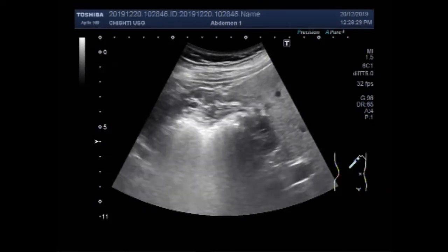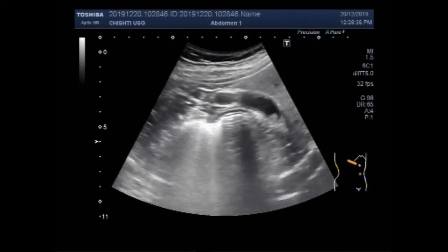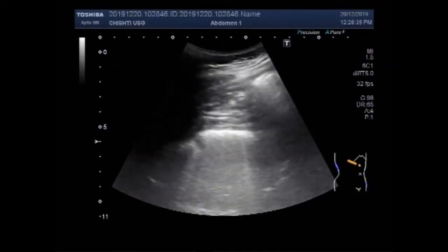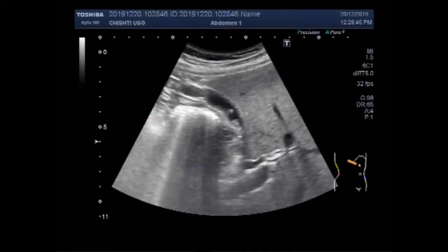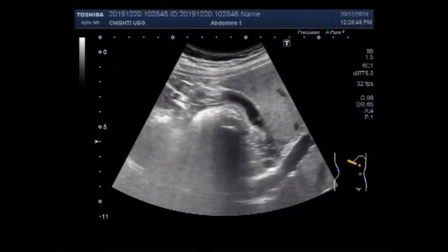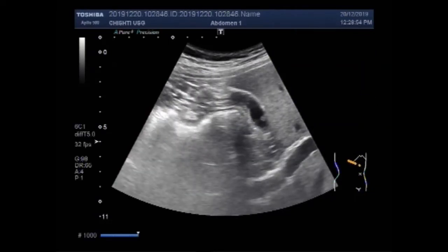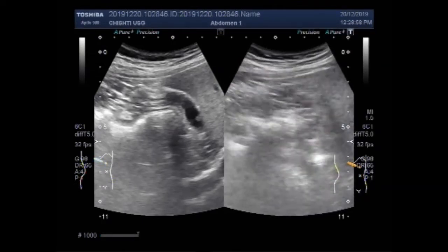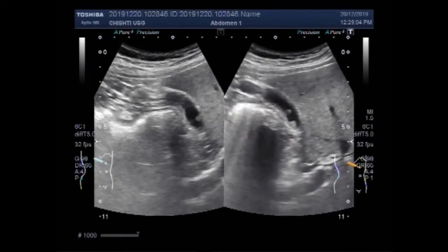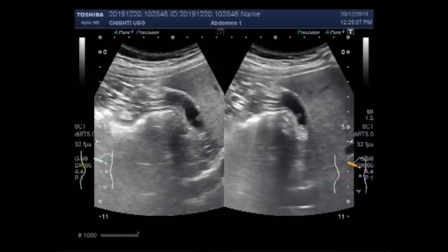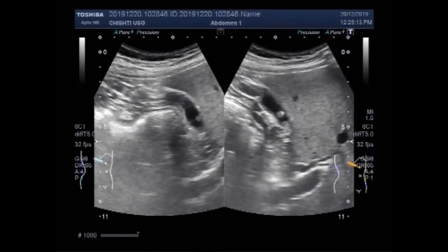The second video also shows sand particles and thick sludge in the gallbladder. In this first video, you can see the gallbladder polyps near the neck of the gallbladder. There are multiple polyps — two to three or three to four polyps are seen along the anterior and posterior walls of the gallbladder near the neck.